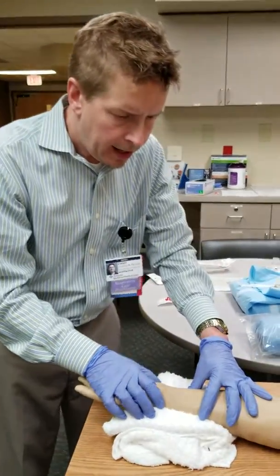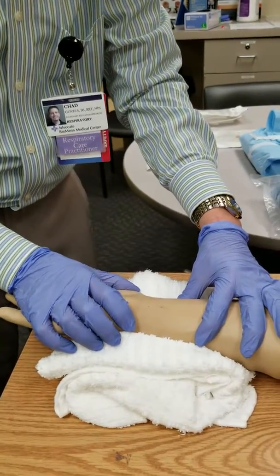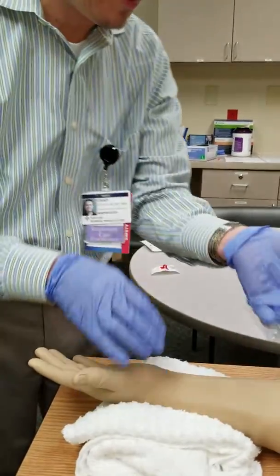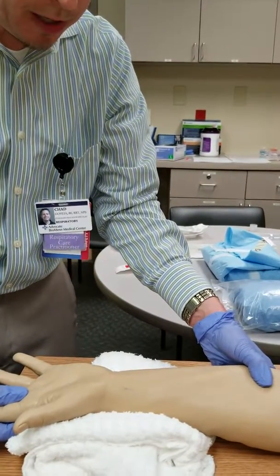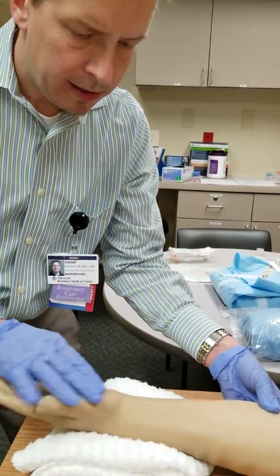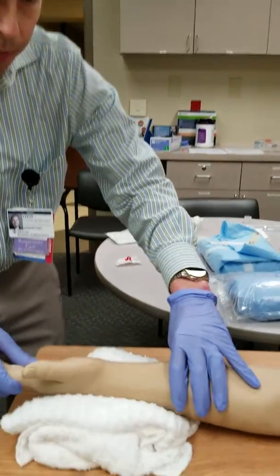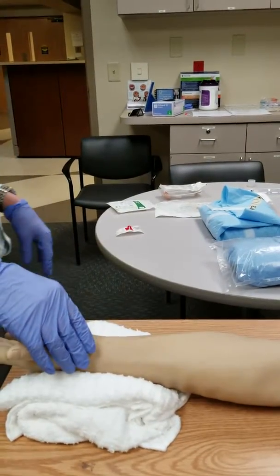The most critical thing in acquiring an arterial line is the position of the arm. You want the anterior portion of the surface you're going to poke to be most anterior. Oftentimes when we acquire arterial blood, the patient's arm is off to the side — and so is the vessel. We want to get this thumb pad up in the air a little bit. We utilize this towel to keep the arm not too hyperextended so we can position it into shape.